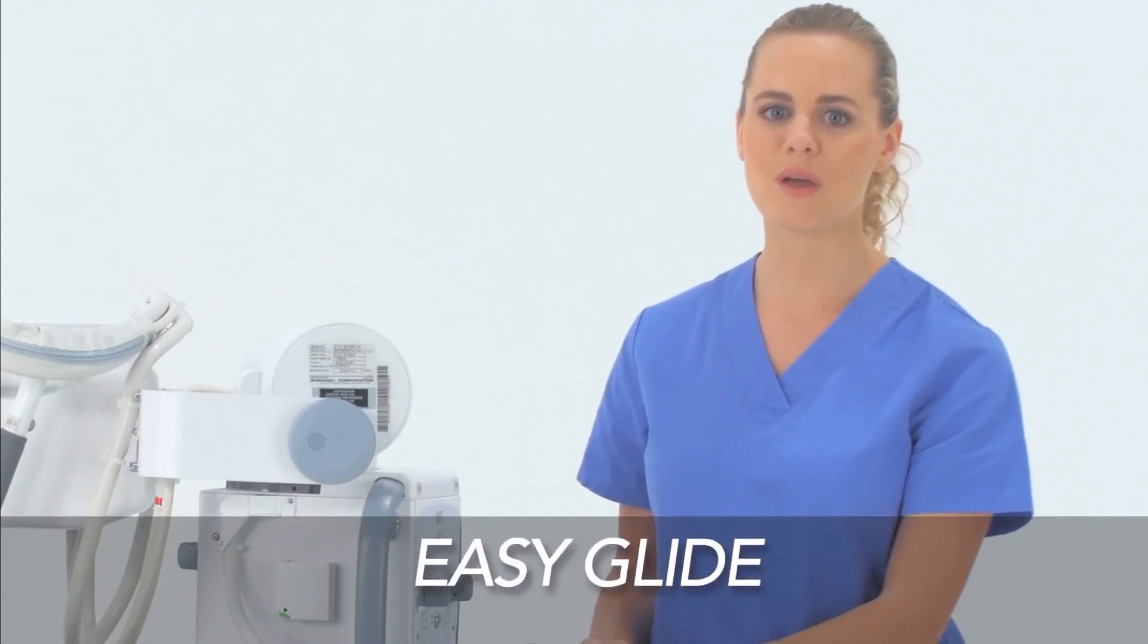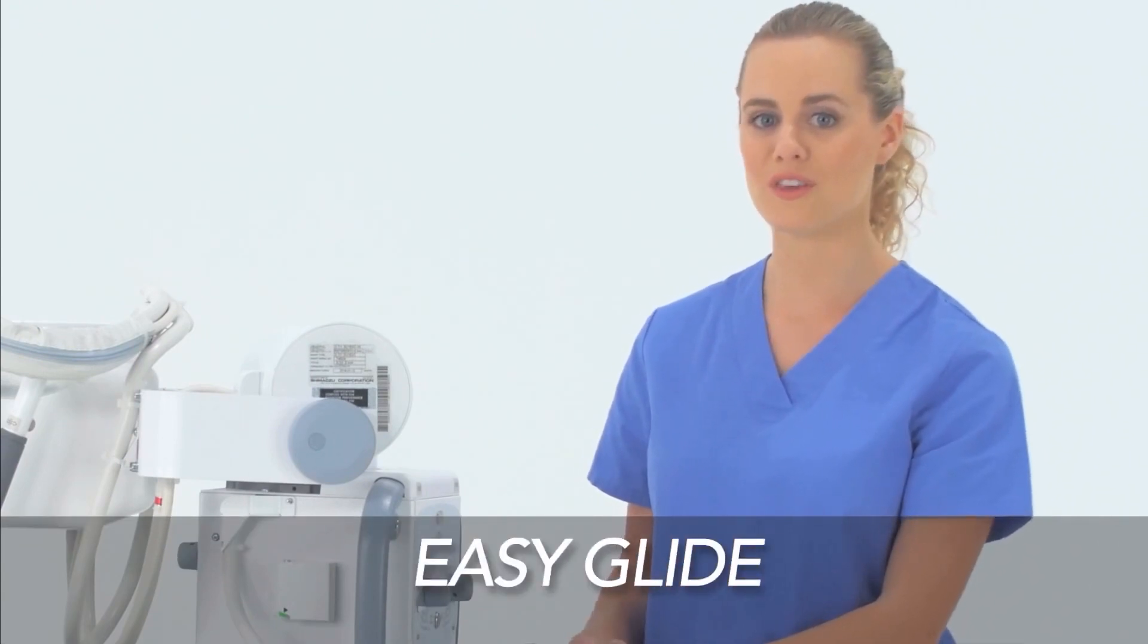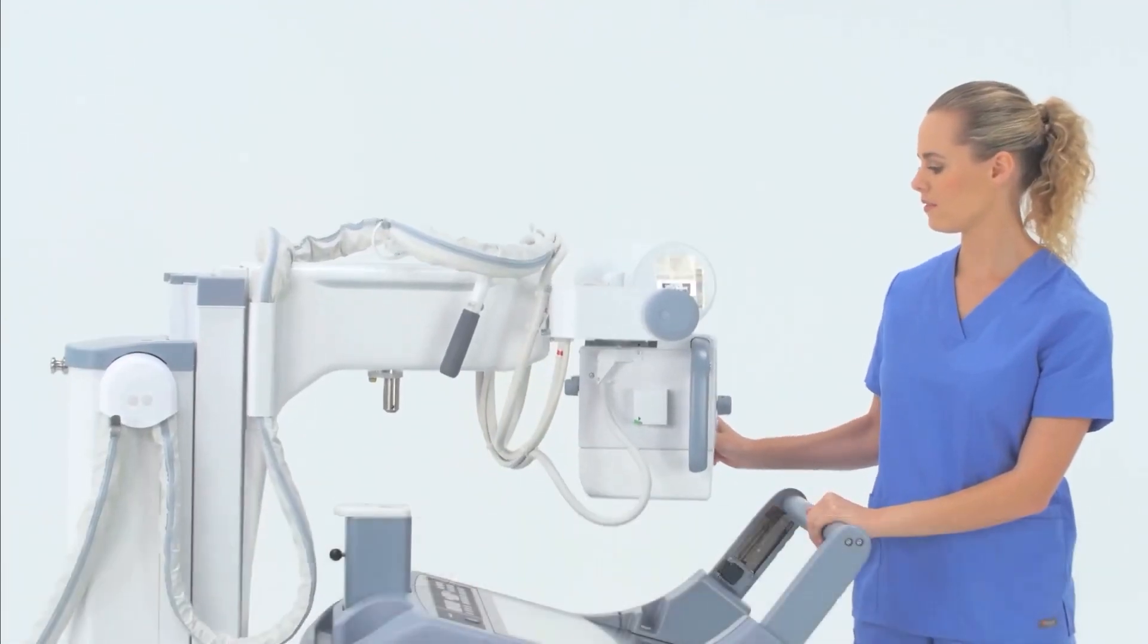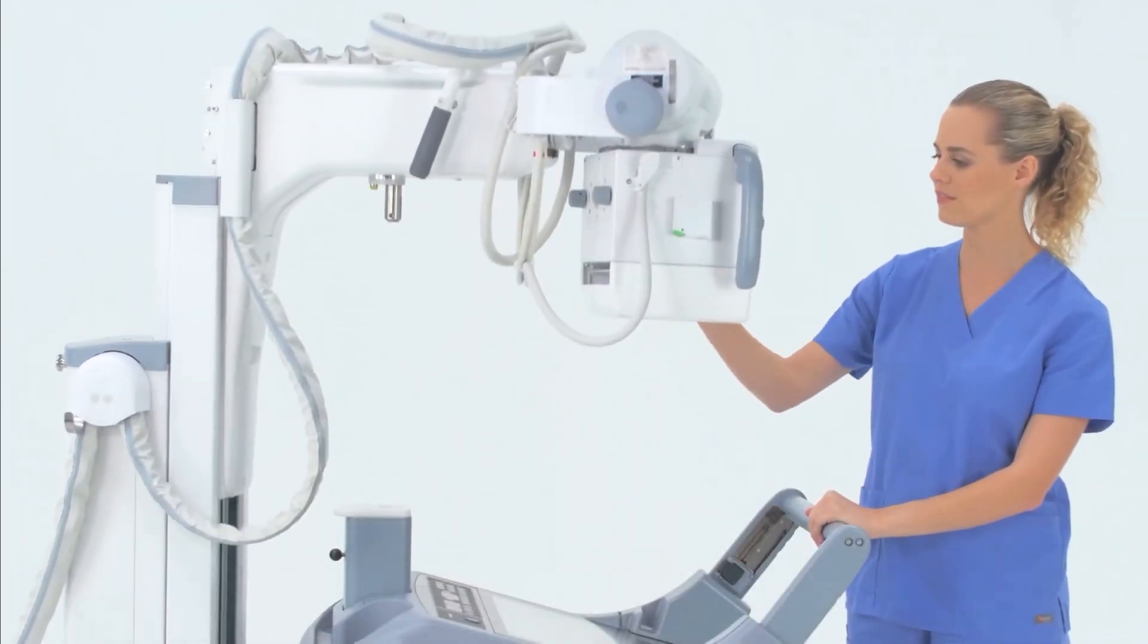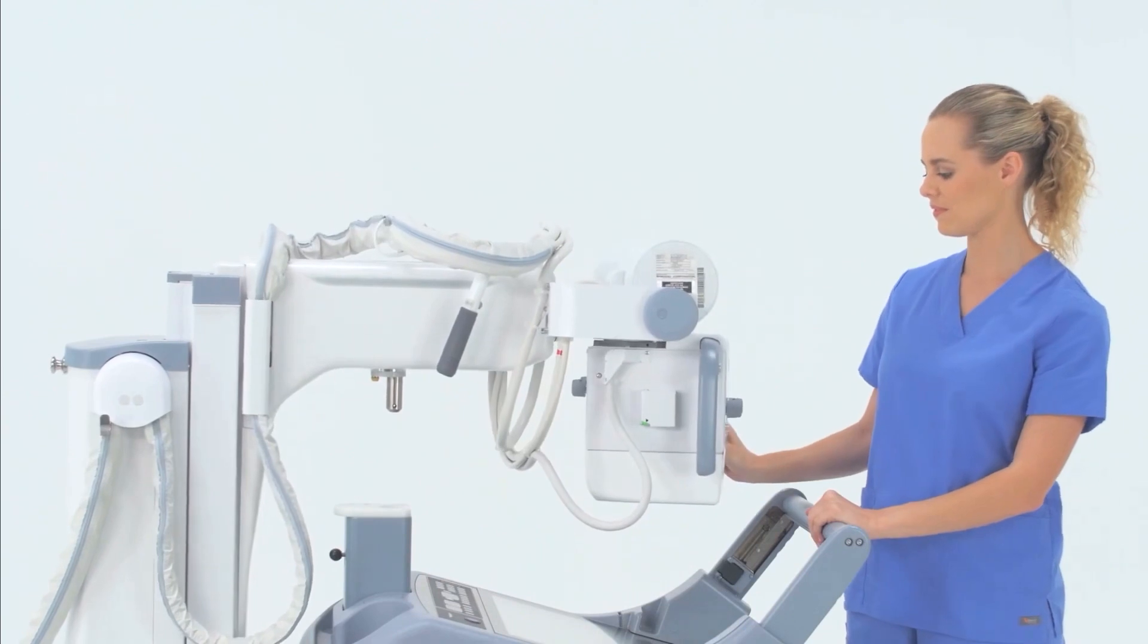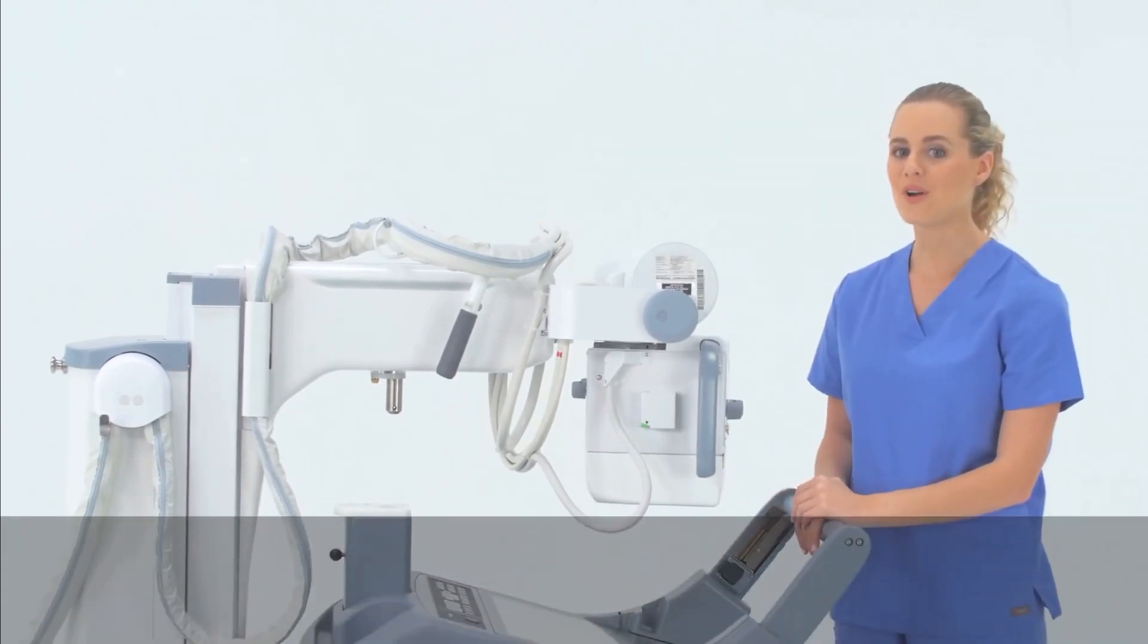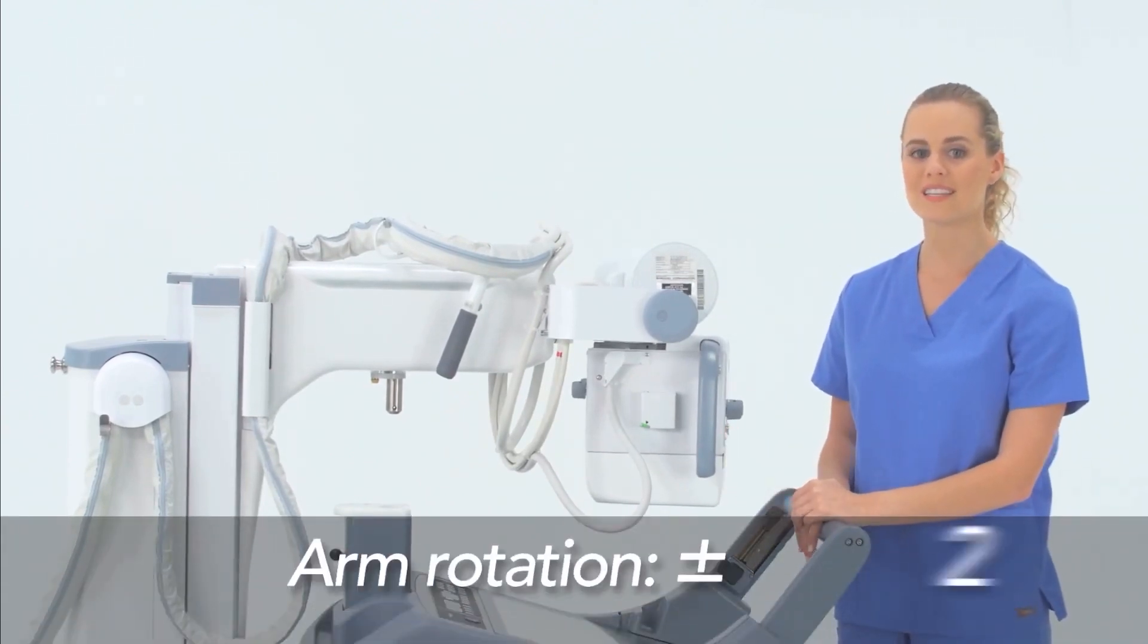When the collimator is freed, you will notice that it moves much more easily thanks to a new feature called Easy Glide, which reduces the amount of force necessary to move and position the arm. This allows arm rotation up to 270 degrees in either direction.